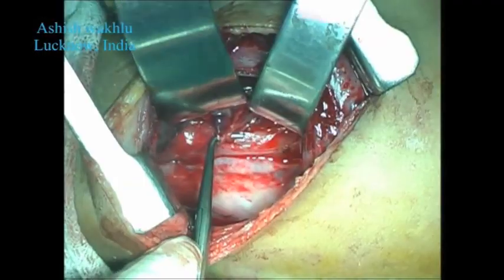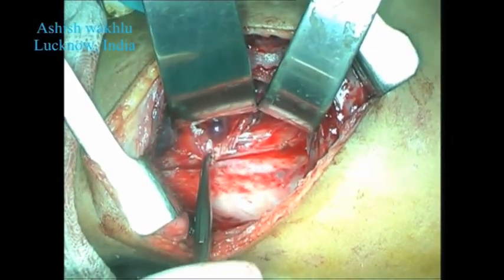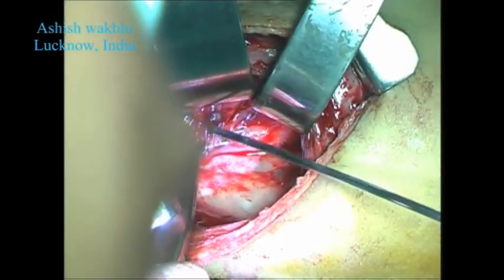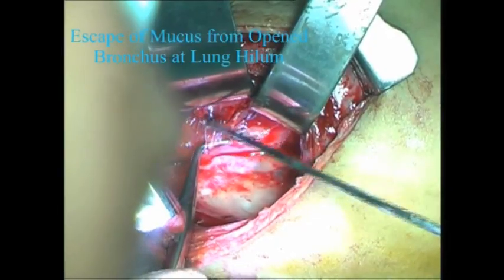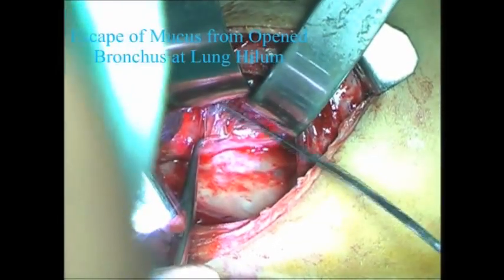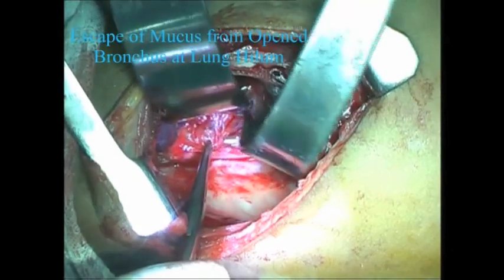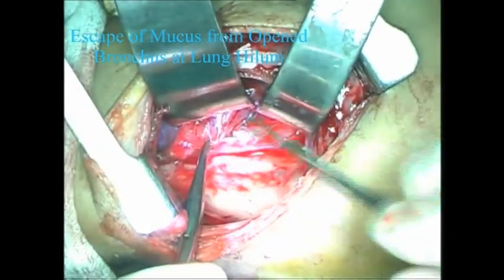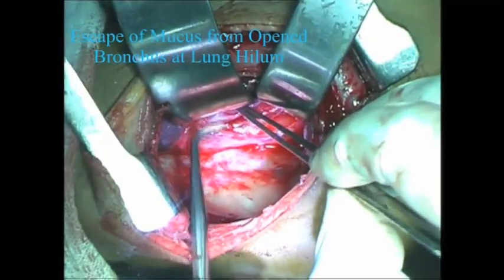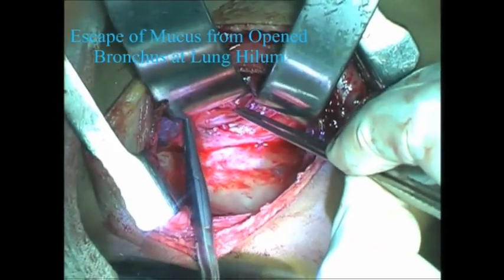So we can see that we have exposed the stump of the right main bronchus on the side of the lung, and secretions are coming out from the collapsed lung, mucoid secretion. And this is the point of bifurcation of the main bronchus into the upper and lower lobe main stem bronchi, which has been opened. And this will be the point which will be anastomosed to the stump of the right main bronchus.